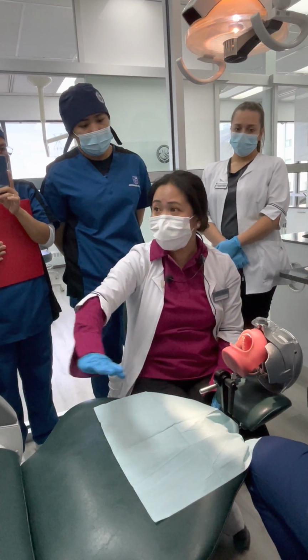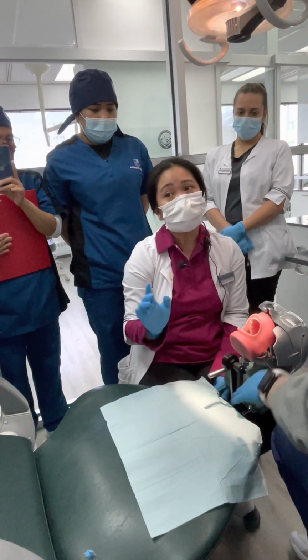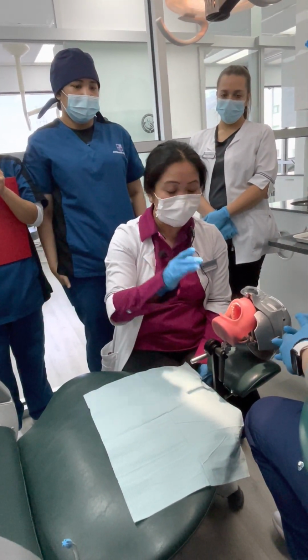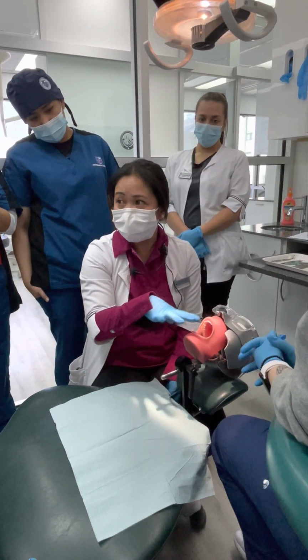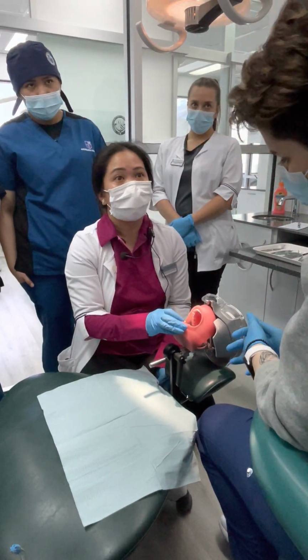It should be 90 degrees for mandible, okay? It doesn't have to be exactly 90 degrees or 25 degrees, but you know what I mean, right? Make sure that you and the dentist can clearly see the mouth, or inside the mouth.